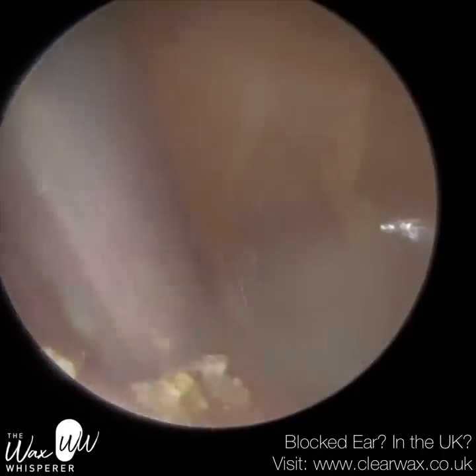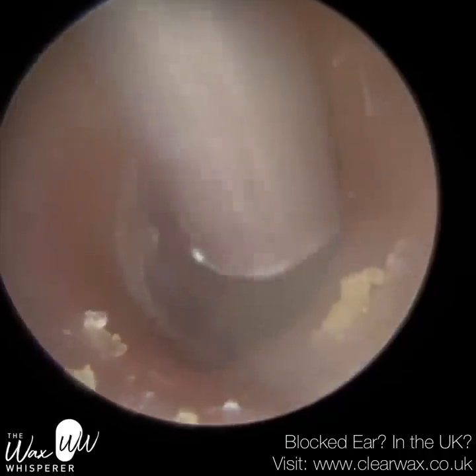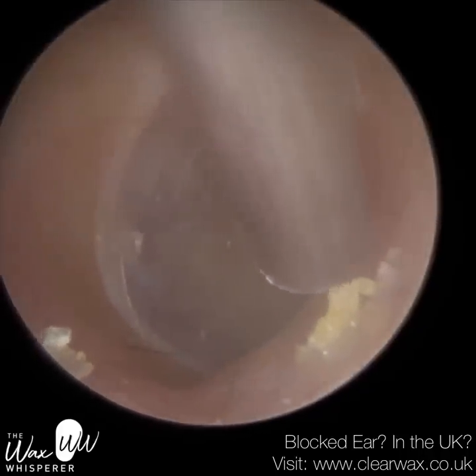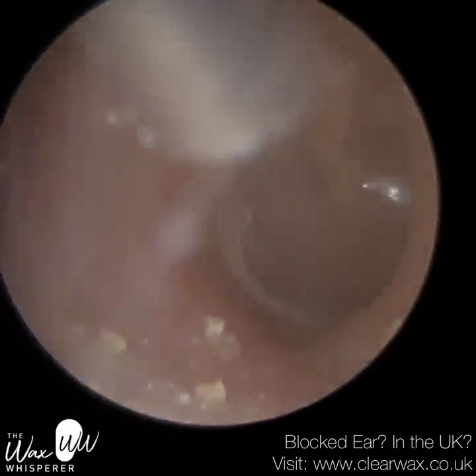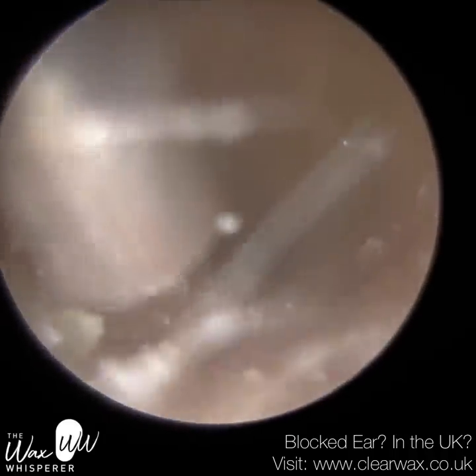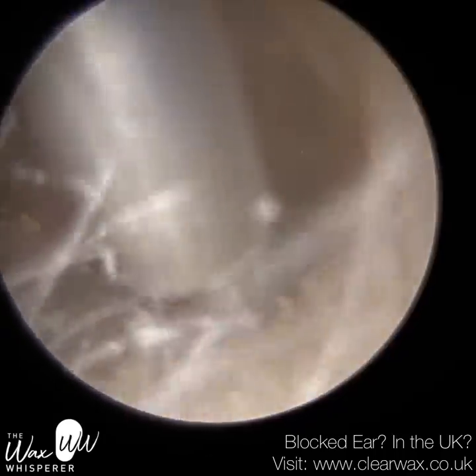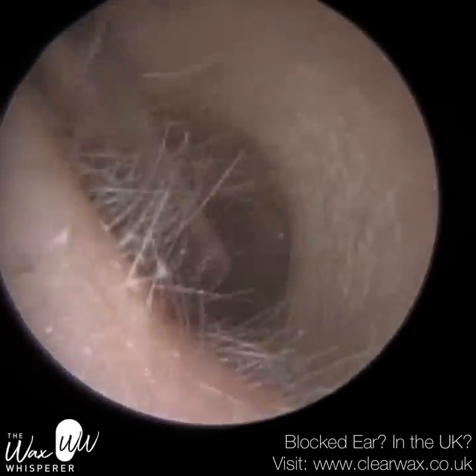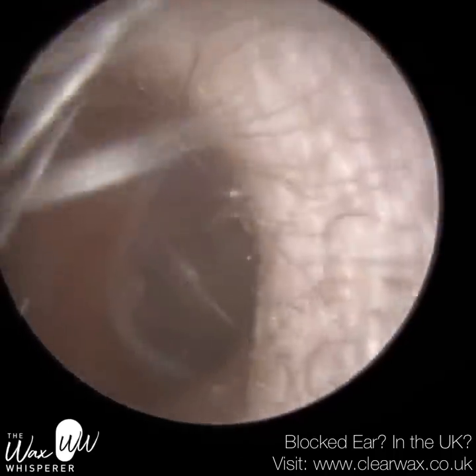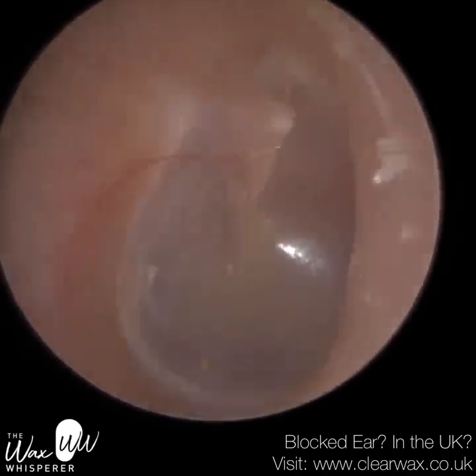I've seen it in textbooks and surgical videos that I watch sometimes, but I've not actually witnessed it myself. It's a great view. We can see some blood vessels and capillaries as well. We can see the incudostapedal joint — that's where the incus bone attaches to the stapes bone. It's a ball and socket joint. I've annotated it, so stay tuned for that, which is coming up now.